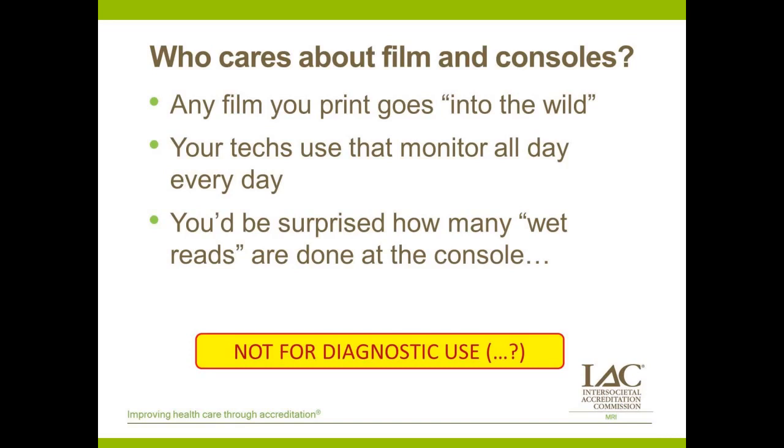When it comes to the console monitor, the argument I hear, from 99 out of 100 people is, why do you guys insist on sticking a photometer up to that monitor? Nobody reads off of it. Well, your technologists are sitting at that monitor all day, every day.